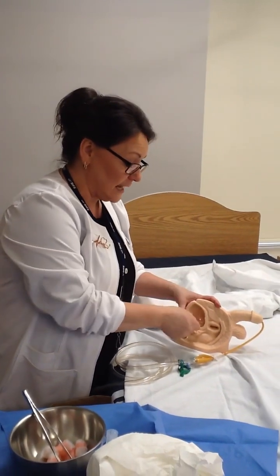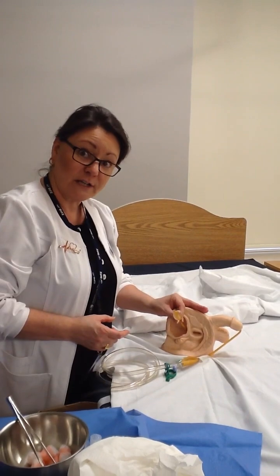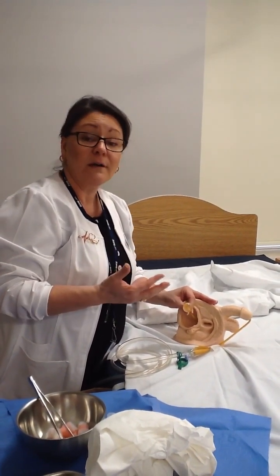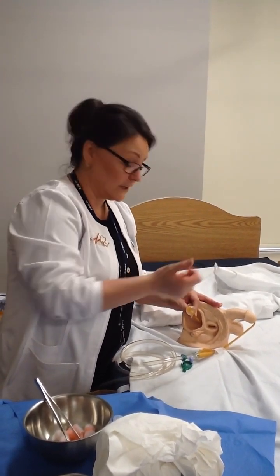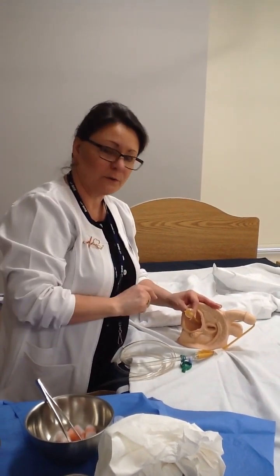And you can see how important it would be for the nurse to document that there was 10 mils of water in there, because if another nurse came along and didn't know that, or didn't know there was 10 and maybe only took out 5, you can imagine how much damage and pain that would cause our patient if we tried to pull that catheter out with the balloon inflated.